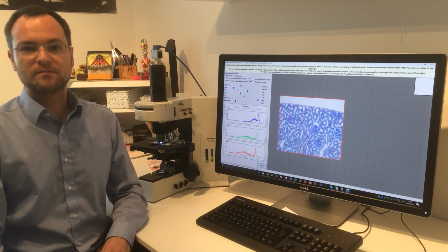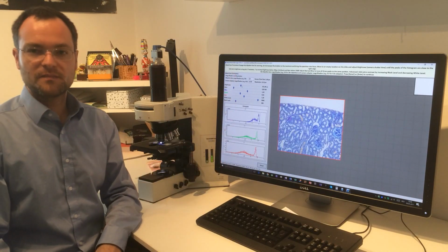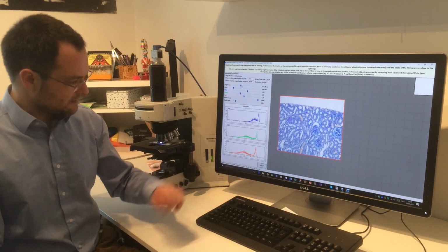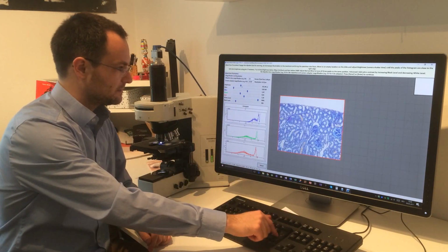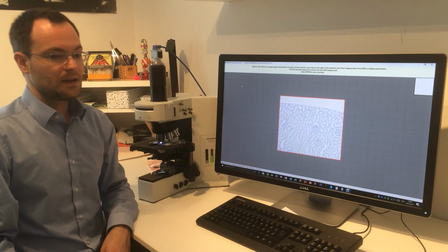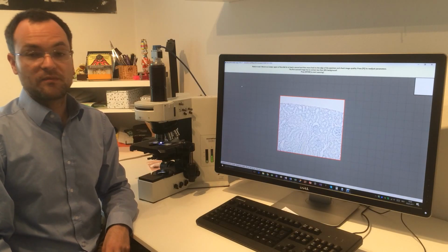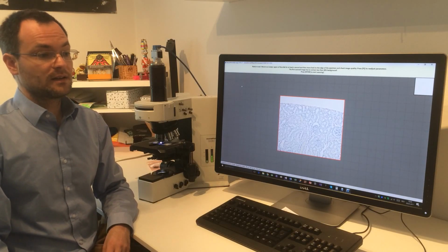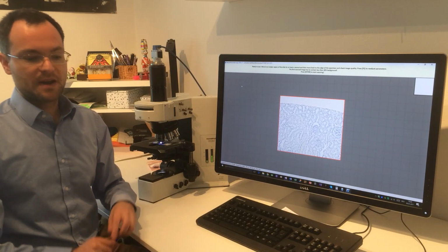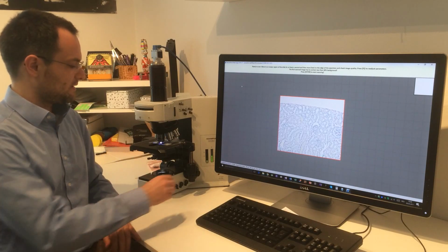In the previous video, you learned how to set up the scanning parameters on the left. The next step is to press the done button or hit enter. Now you can see that the image is getting brighter and you have to show an empty part of the slide to the camera. This is to allow the software to estimate the background shading and to compensate for that.